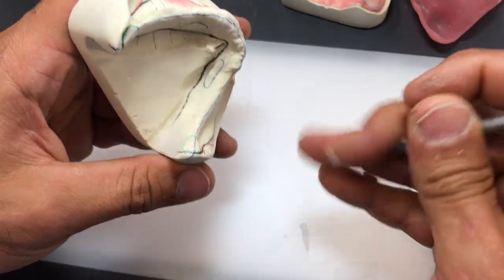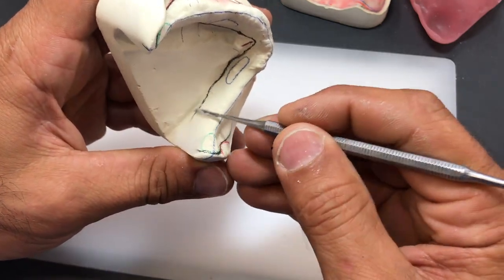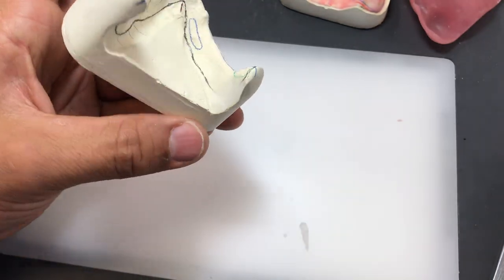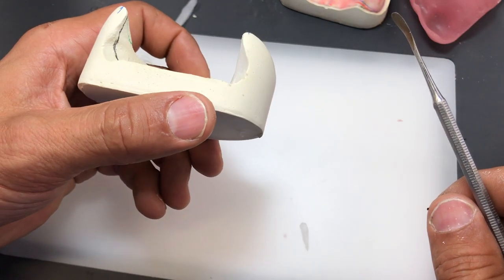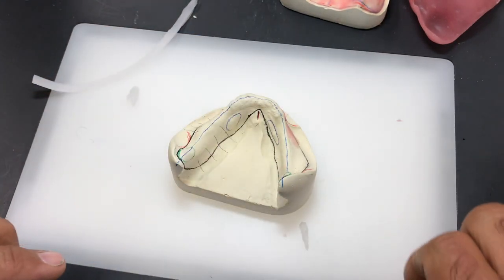Just carve a little bit more so we don't have excess block out. So now you see a vertical wall of block out right there. We need to block that out. So I'm going to do the other side.